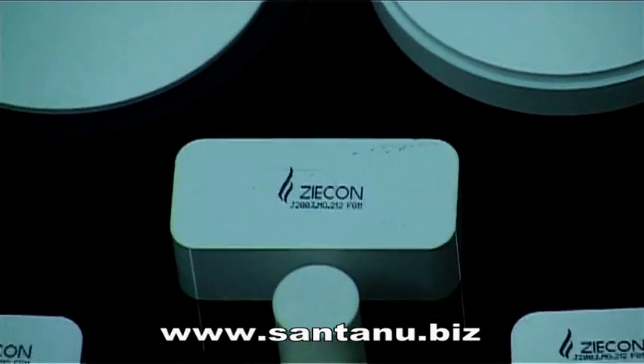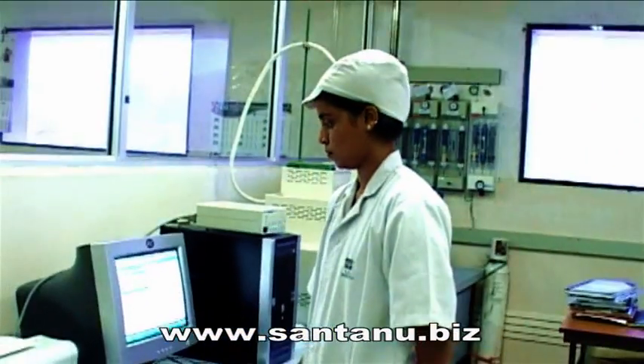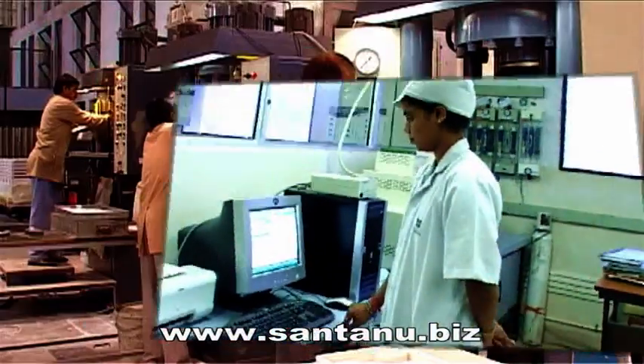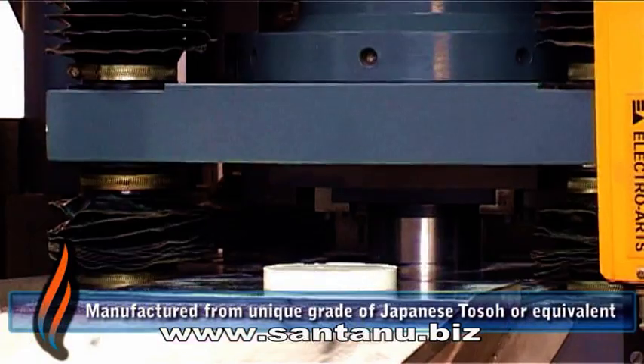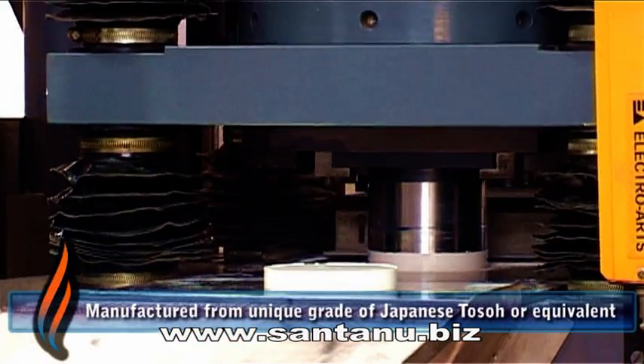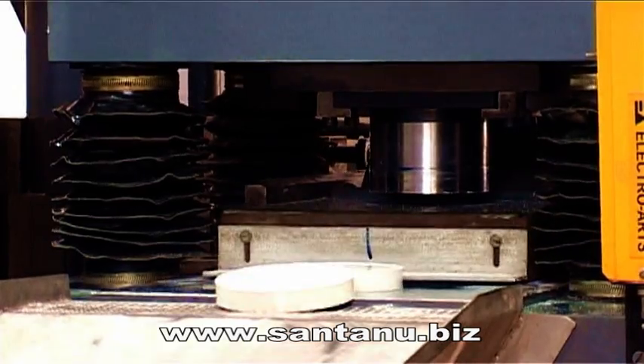Ziecon is a boon to patients, dentists and dental labs all over India and abroad. Manufactured from select grade of Japanese Tosoh, compacted at high pressure in automatic uniaxial and isostatic compacting presses.